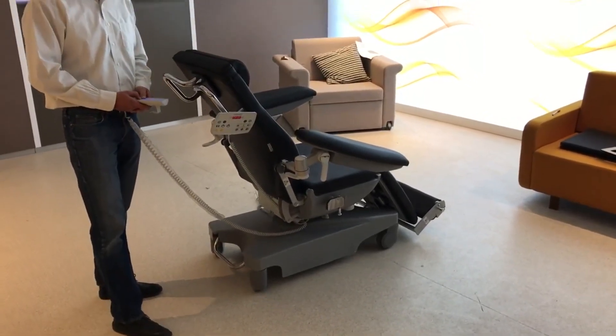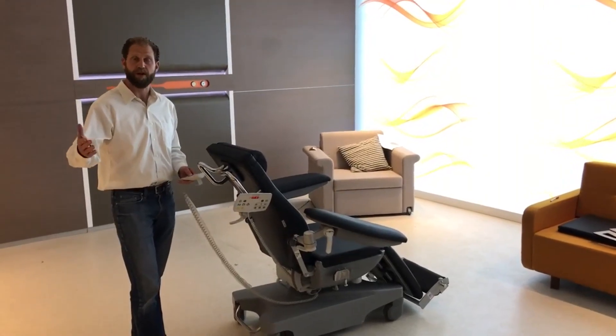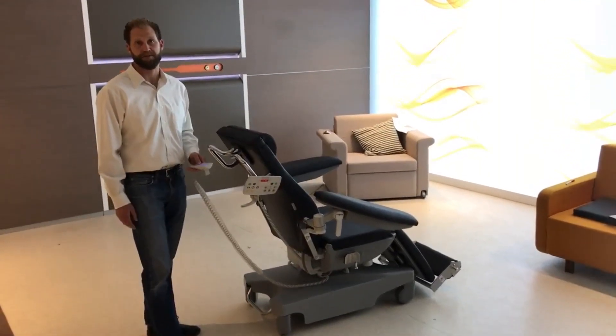So if you have any other questions please look at our website hntmedical.com or give us a call at 888-733-4272. I'll show you what it looks like.